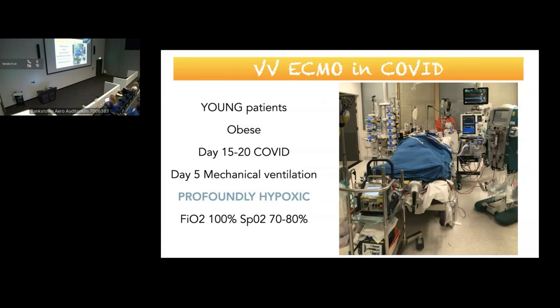Importantly, these patients need time, patience, and perseverance. They are really long runs. We've had patients supported with ECMO for over 4 months. The CT looks absolutely terrible, with respiratory physicians wanting to withdraw care, but they end up having enough lung function to make them functional at home. There are a lot of setbacks and a lot of complications and ups and downs with these runs, but the persistence and the willingness to institute aggressive therapy is actually key to getting these patients through, particularly when they're so young.